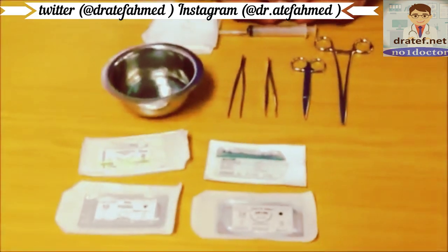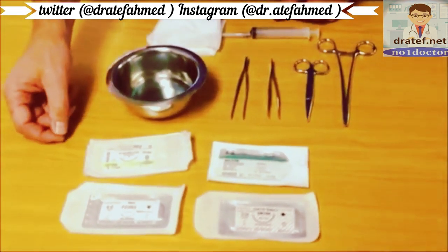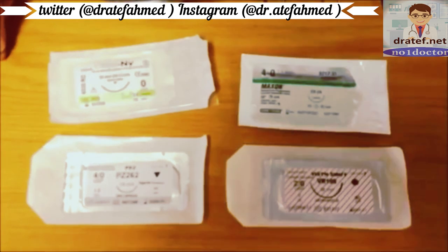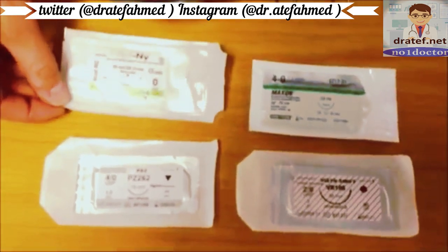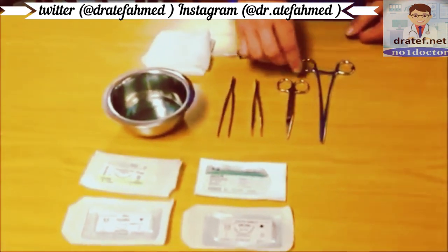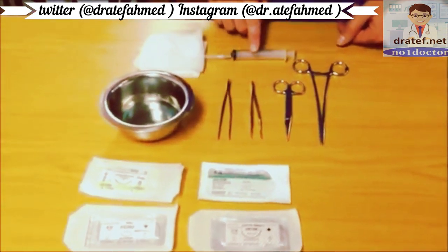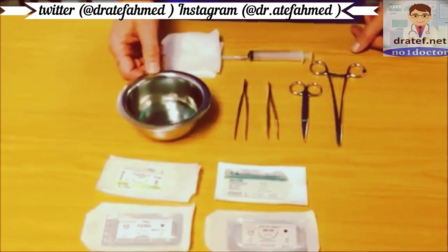The minimum equipment you will need to suture a wound is suture material. There are many different kinds available on the market, and a full discussion of their pros and cons is outside the scope of this demonstration. Today we will use a nylon monofilament suture. You will also need a needle holder, a pair of scissors, forceps, local anesthetic, some gauze, and a cleaning solution.